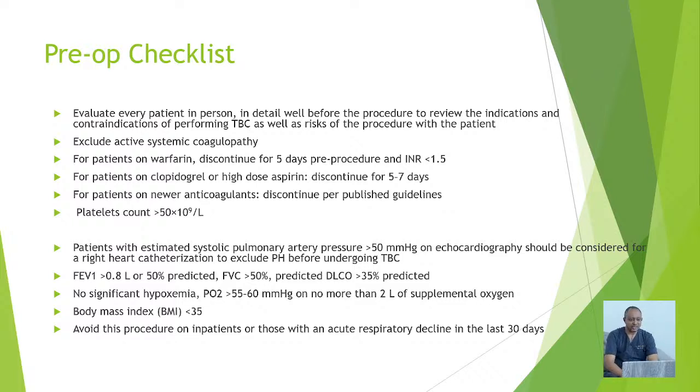So as we prepare our patients in the pre-op period, we have to see the patients. Each patient must be assessed as an individual. We make sure they don't have active systemic coagulopathy. By doing your INR, you can also do a coagulation profile.